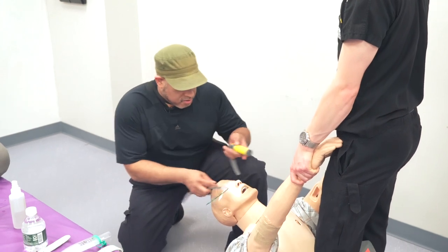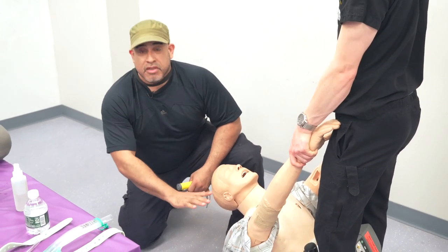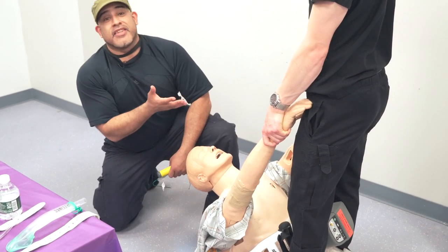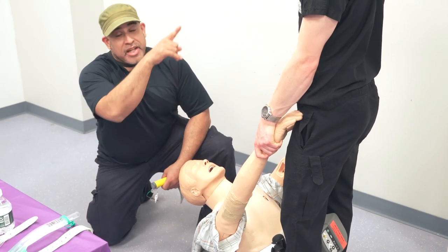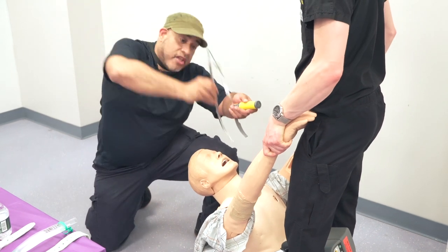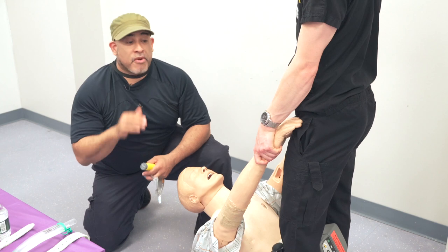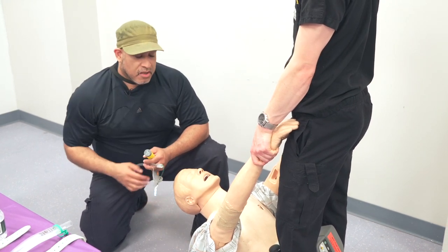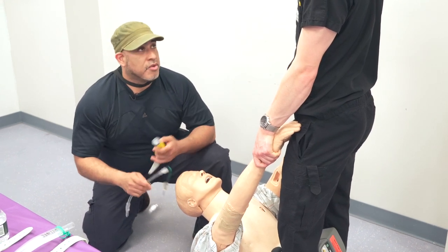The reason this maneuver is ideal: the stomach stays down here, the lungs stay here, and the head is elevated, maximizing intubation. If I were really tall, I would ask my helper to pull it even higher, so I'd be intubating like this. That makes sense? Gravity will help me prevent aspiration, because gravity will prevent passive regurgitation. And this is, of course, not a cardiac arrest patient. This is a respiratory arrest patient with a pulse.